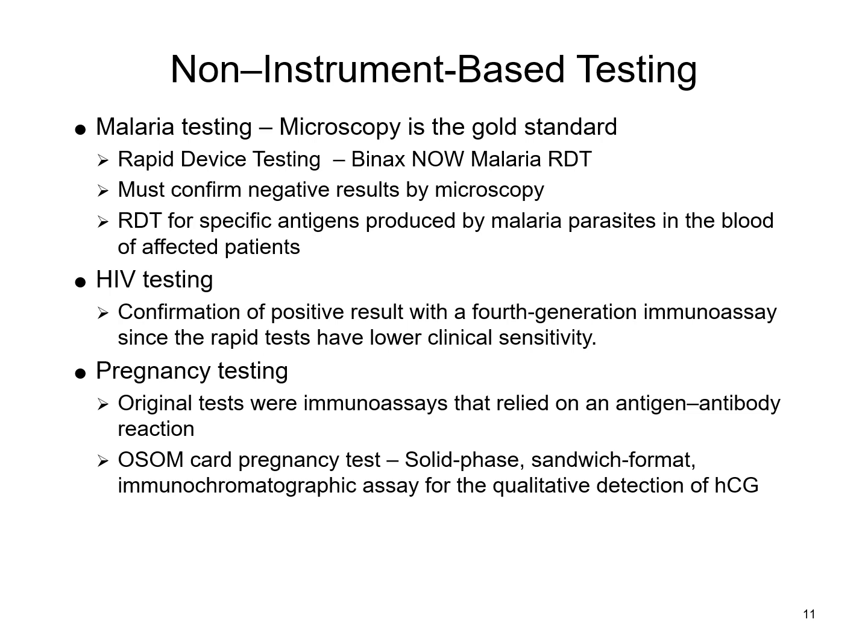What this particular test does is, when the patient sample is applied to the kit and absorbed into an absorbent membrane, it looks for particular antigens that are specific for the plasmodium. It could be some type of protein, but it's something on the surface of that cell that it is looking for.